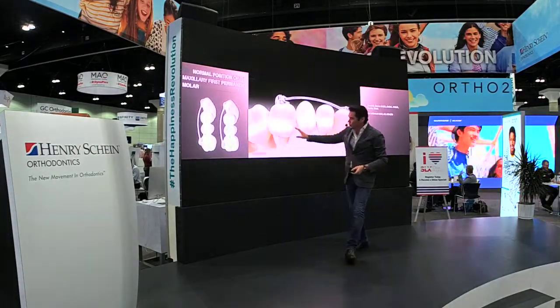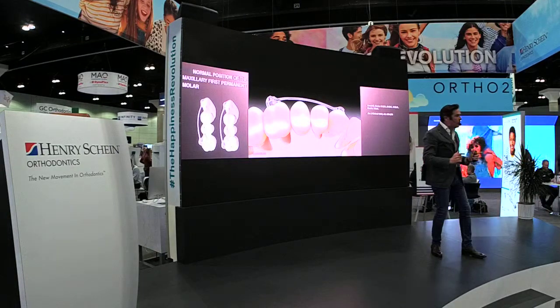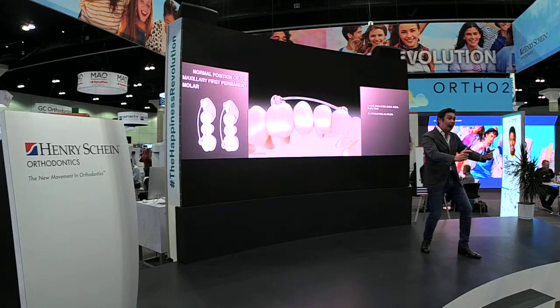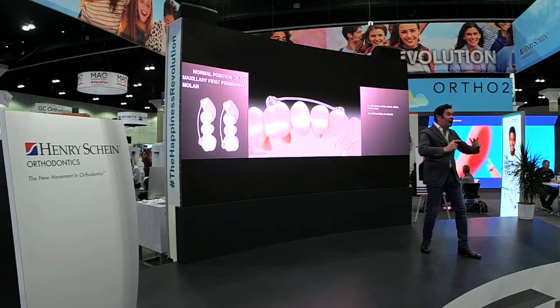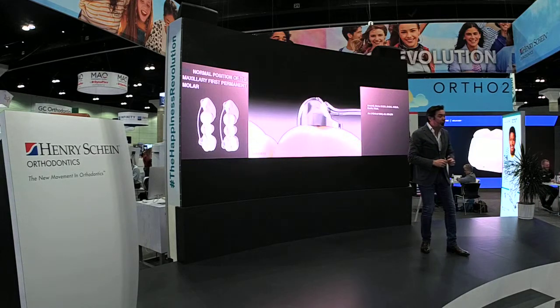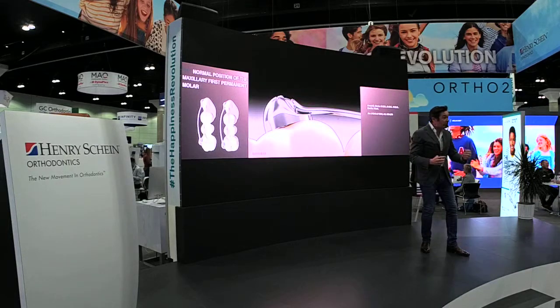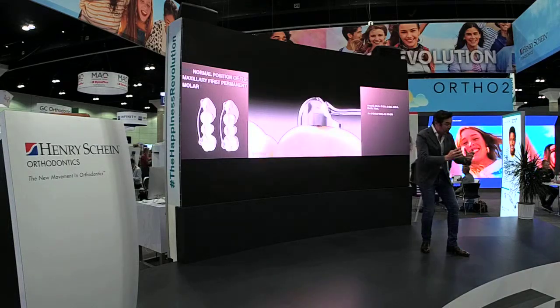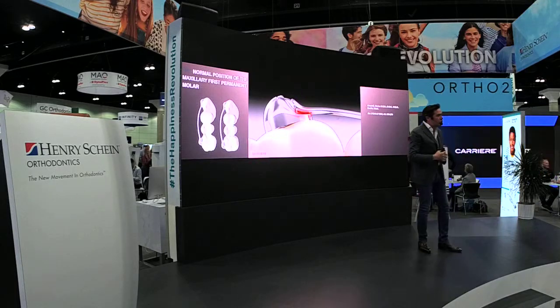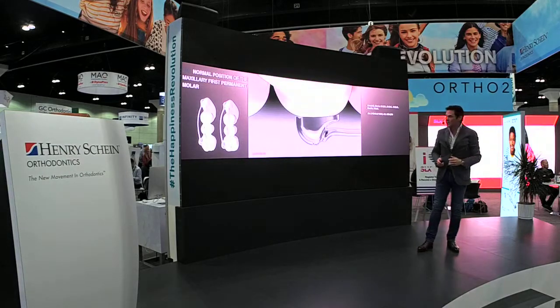So here we have the motion appliance. This appliance is going to convert the class 2 into a class 1 at the beginning of the treatment. This appliance is going to regenerate a class 1 scenario just at the beginning of the treatment, and from this point, everything will be easier to solve, especially with aligners, because the aligners are going to be able to solve efficiently the malocclusion of the patient, because they will not have to deal with the sagittal relation, with the sagittal condition.